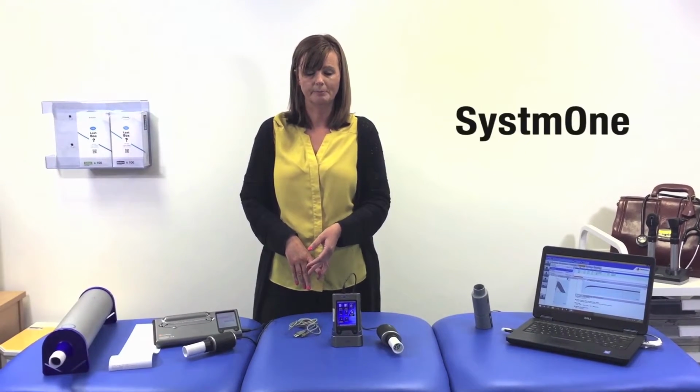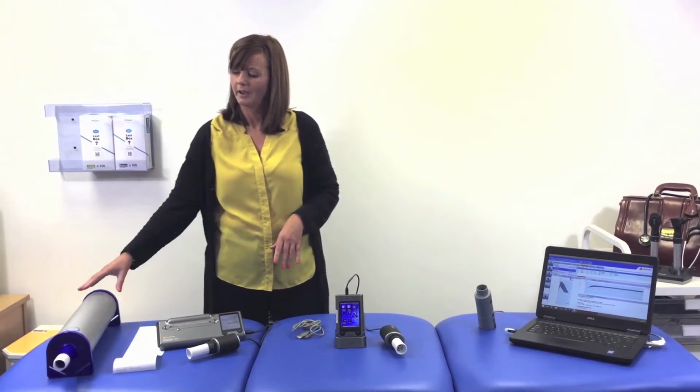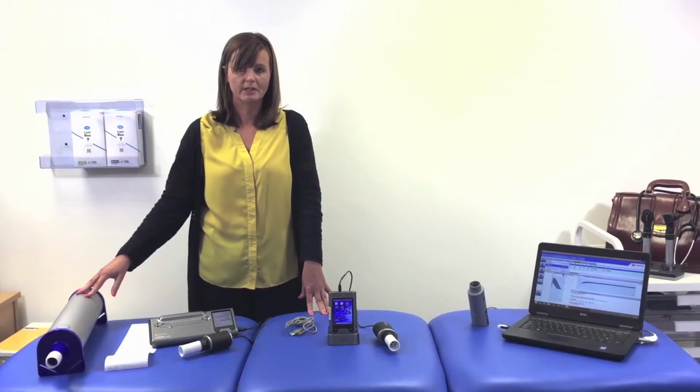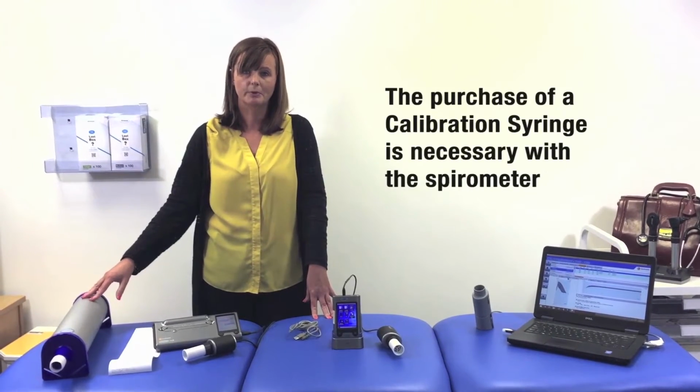I would recommend when purchasing these that you purchase the SPCS software that's available. Without the SPCS software, you will not be able to connect your spirometers to your patient record systems such as EMIS or System 1. On the end here, we have the 3-litre calibration syringe. If you don't have one of these currently, you will need to purchase one of these with your spirometer.